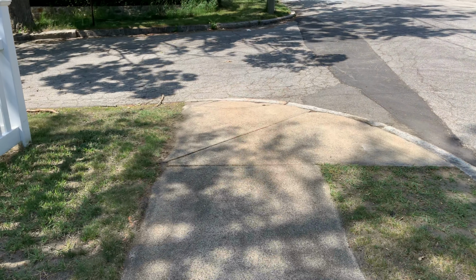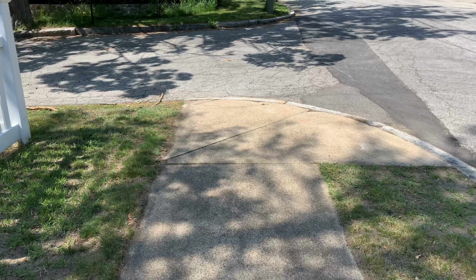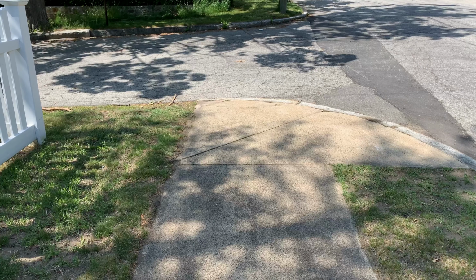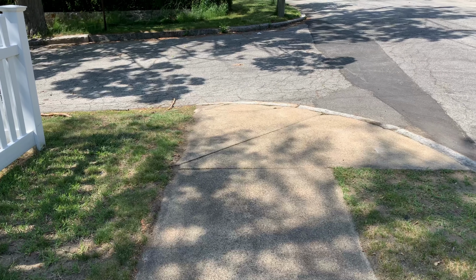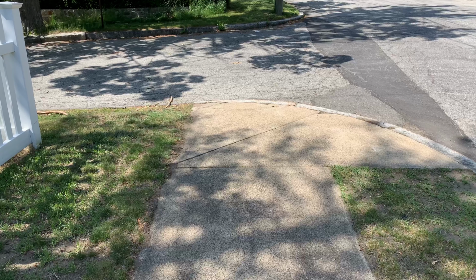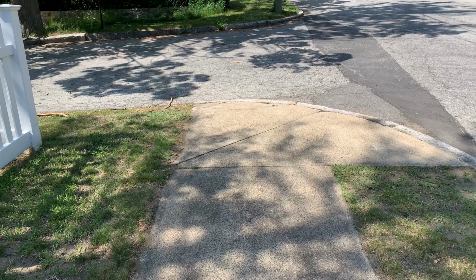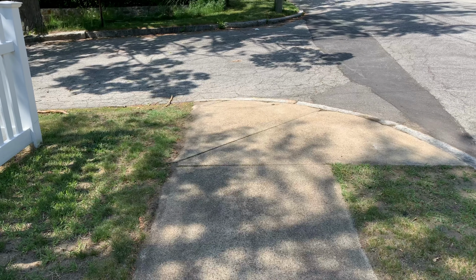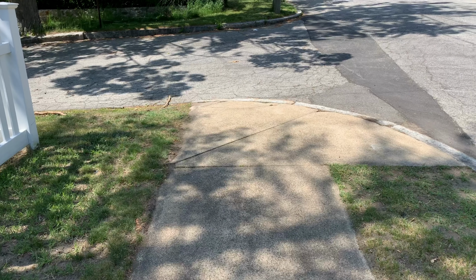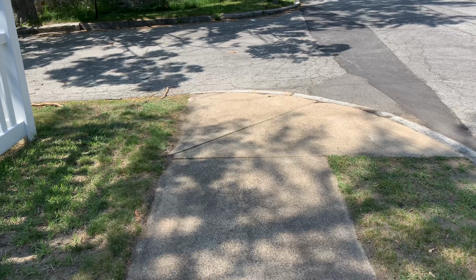All right, so I'm going to start my demonstration here with a kind of an older style corner. So this corner, it does not blend into the street like a lot of the newer corners that are out there, but there's still a lot of these around, and it's important to know when you've come to one of these corners. And the way I like to teach this is to use the cane and the tactile feedback you get when the cane tip drops off the side of the curb or the edge of the curb.